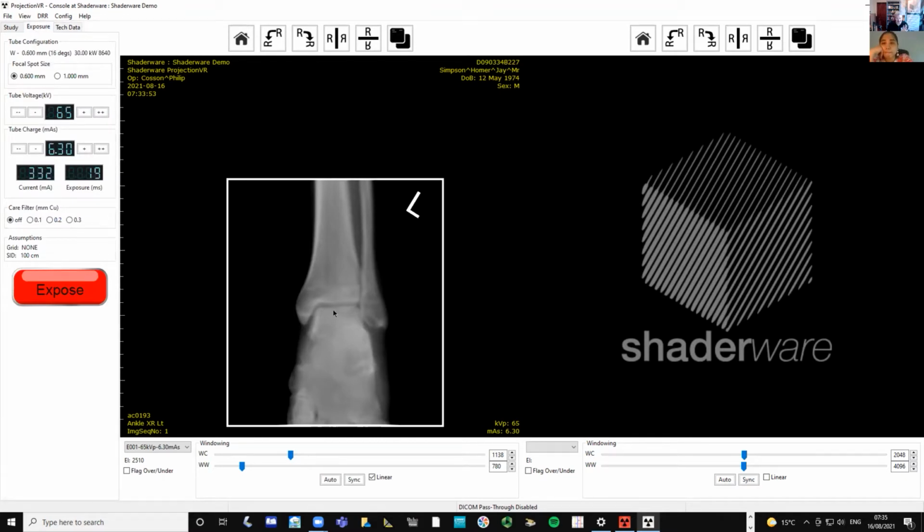Okay, so that's great. That's really good, because our second year students, because we're still on quarantine measures, were not able to do the laboratory last semester. Last year, there were really no laboratories at all, and image production and radiation production were all on hold. The laboratories were not executed, so this will be very helpful software for us, so that we can trace back what we left off from our students, and they can perform it here.